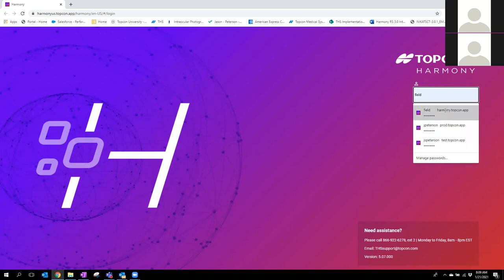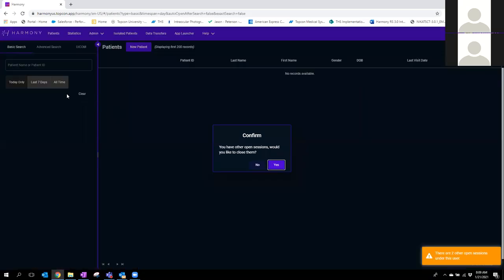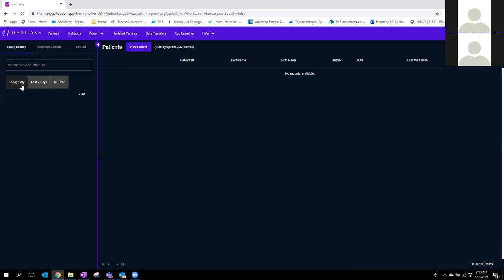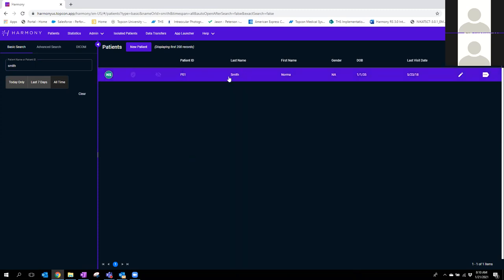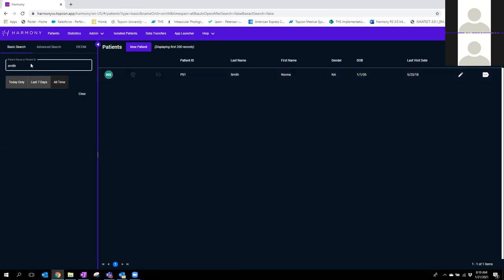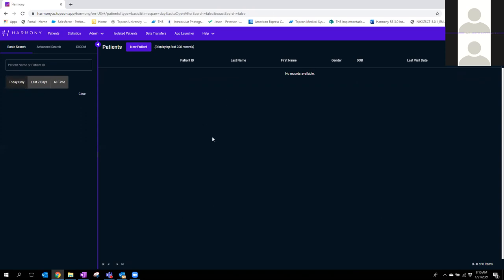I'm going to log in and show you. Right now things look blank — I'll explain that. On the left side you have a basic search box where you can search by patient first name, last name, or patient ID. This works when you're using Harmony on its own. If you're using Harmony via hyperlink through your EMR, it's going to look like this when you log in — you'll see one patient record. You'll get to this exact point and your only choice will be to select it to open it up. It defaults to today's only, so if your patient flow is 20 or 30 patients, you'll see them on the list on the right side.